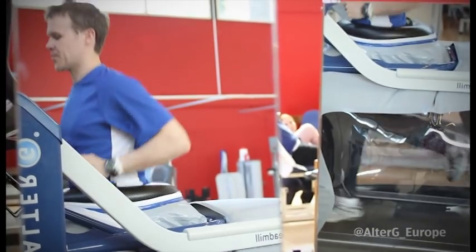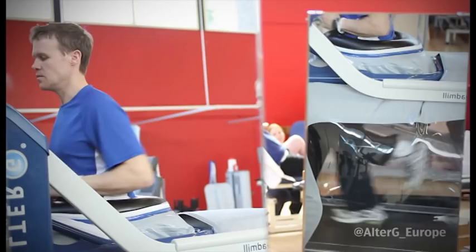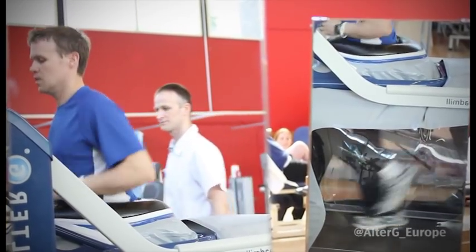You get up and put all your body weight through it — it's a bit much — but you have to start somewhere. I didn't realise the fact of where you do feel like you're in space. If you really want to, you can take all your body weight off so your feet are just impacting the floor with no weight at all, and then that inspires confidence so you can lower your body weight on as you need to.